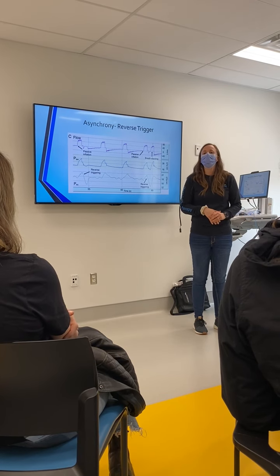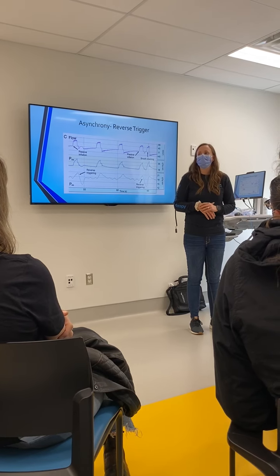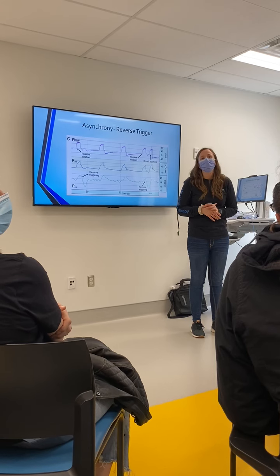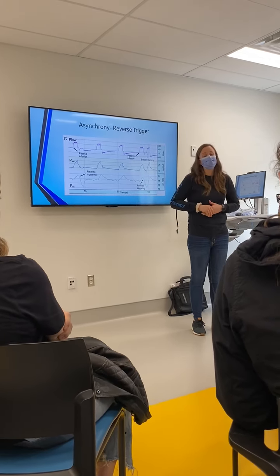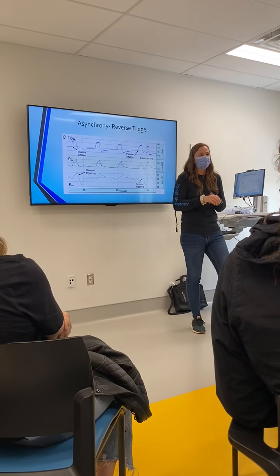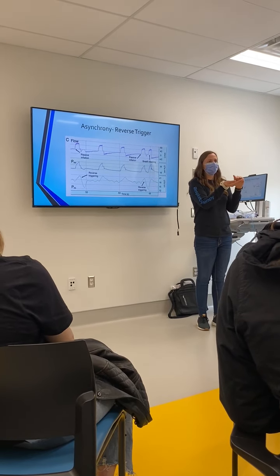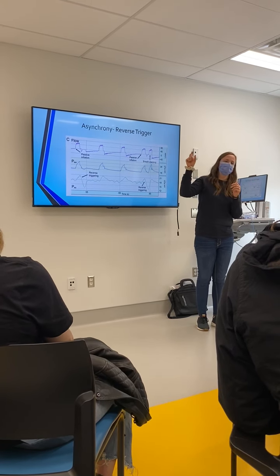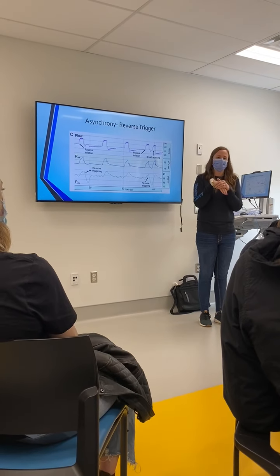We did it and we just took the value before and then after and used that to correlate it. You would know the difference from what you started with. That makes sense. So what he's saying is, if you take your plateau and your transpulmonary plateau is 25, you flip them and the transpulmonary plateau is 28, then you know you have to increase your thresholds by 3, because that's the difference of having them prone versus supine. Does that make sense?